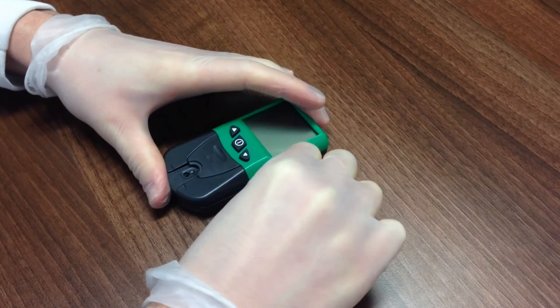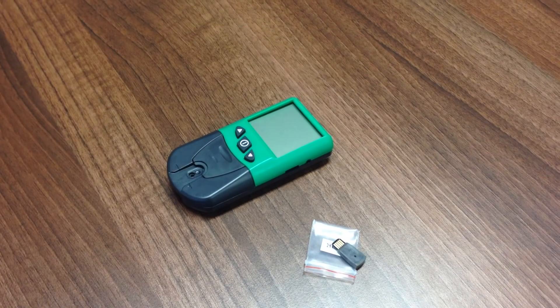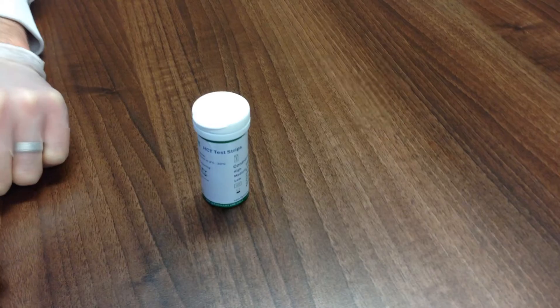Remove the code card and turn the meter back on. When the lot code and time/date are displayed, the meter is ready. Please be aware that the species code chips are lot specific. It is important to use the correct code chip for the species, but also the correct chip for the lot number of strips.